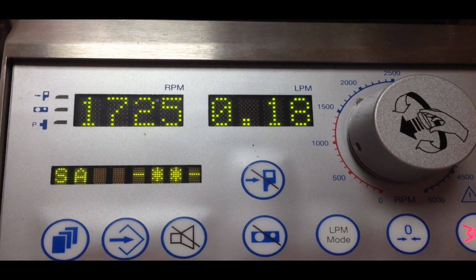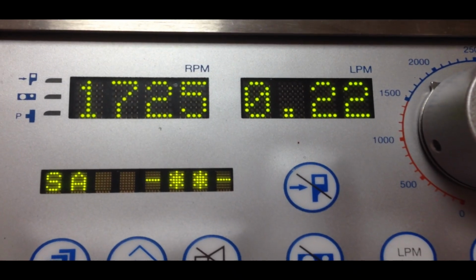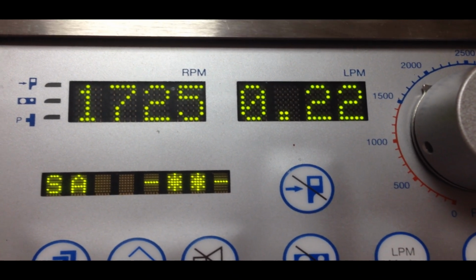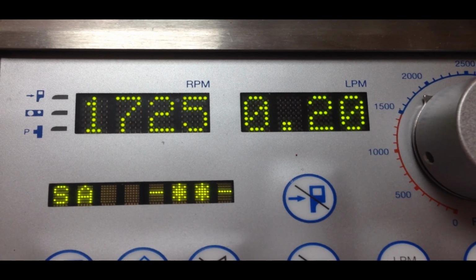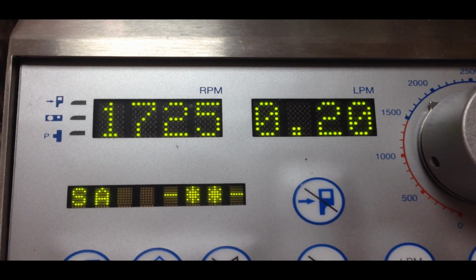In this video, this is a console for a pediatric child. There is some air, so the flow started to decrease, and this alarm shows that the flow is decreasing, so we must manage the air and correct the condition before restoring the flow.